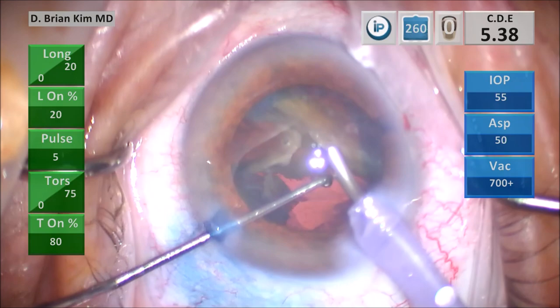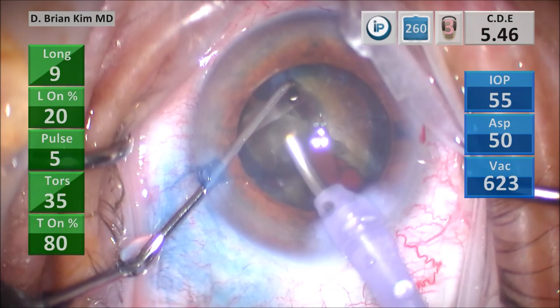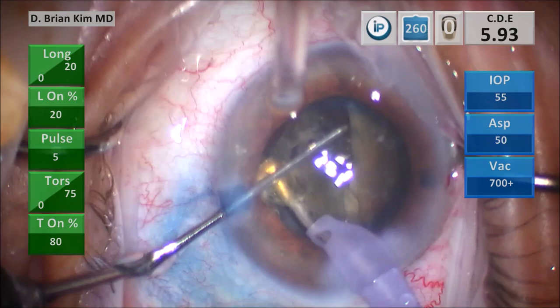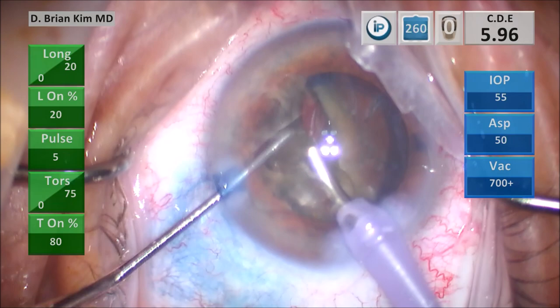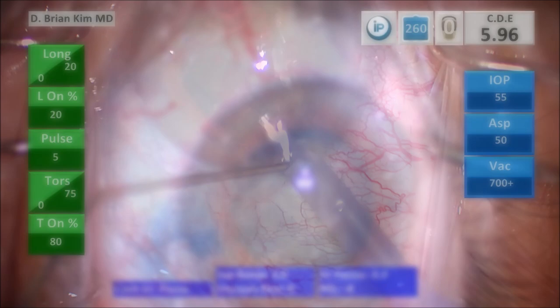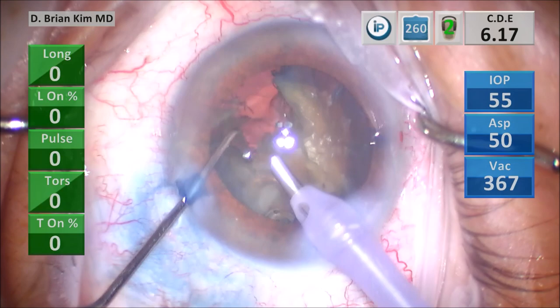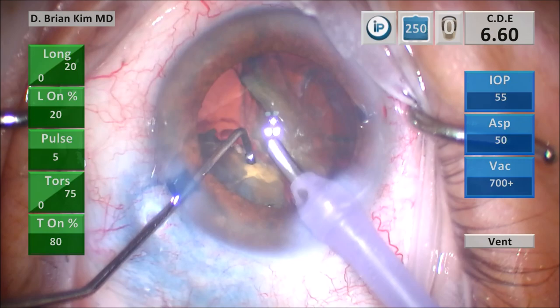I turn the second hemi-nucleus in front of me and attack the remaining fragment from the first hemi-nucleus, sandwiching and crushing the pieces into smaller pieces, then emulsifying. At this point I realize something's not right — I'm using ultrasonic energy but it's not really doing anything. I go out, push viscoelastic in the eye, and then flush the tip. The technician is able to flush the tip and now I'm getting better evacuation. The tip was clogged, which was making it a lot less efficient — the pieces weren't moving. Even though there was vacuum, the ultrasonic energy wasn't doing anything.